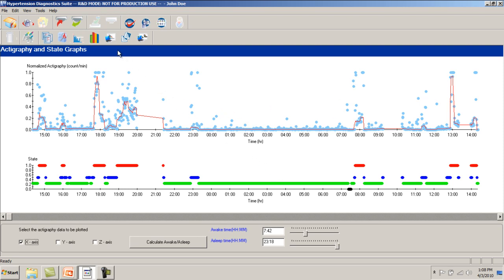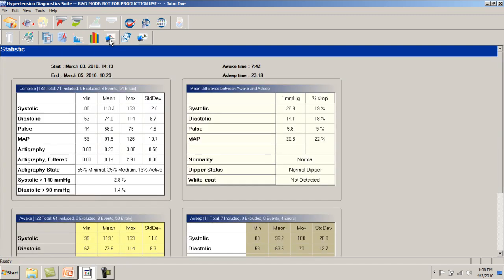The statistics view provides one of the quickest and most effective snapshots of the results of the ABPM procedure. It provides the total number of measurements taken along with the number of errors and events recorded. Of particular interest should be the mean, or averages, of systolic, diastolic, and heart rate for the procedure during both awake and asleep times. Other useful information includes the load factors. This is the percentage of measurements exceeding a particular limit, set in the table view, for both systolic and diastolic during the various time periods.